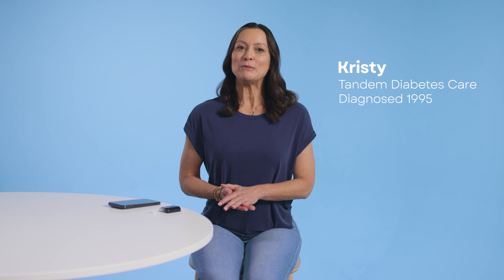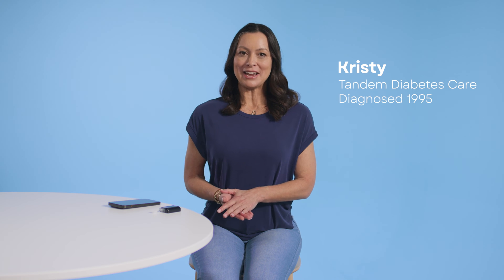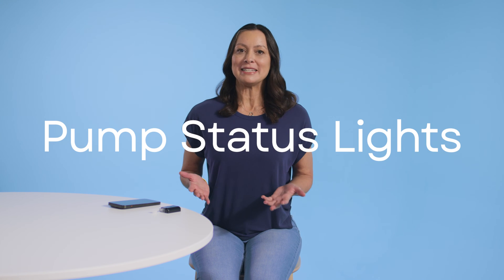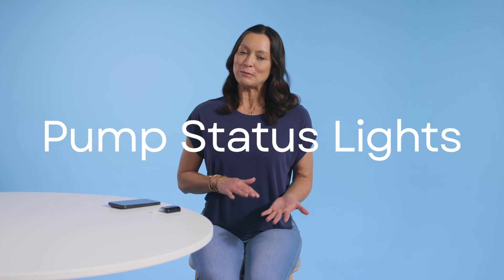Hi, I'm Christy from Tandem Diabetes Care. Let's talk about the pump status lights on your Tandem Mobi pump.